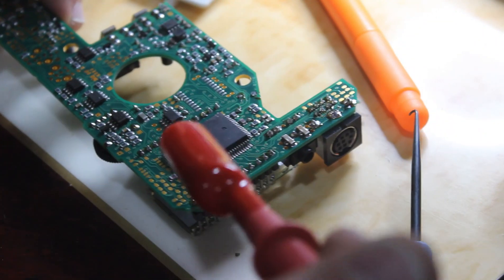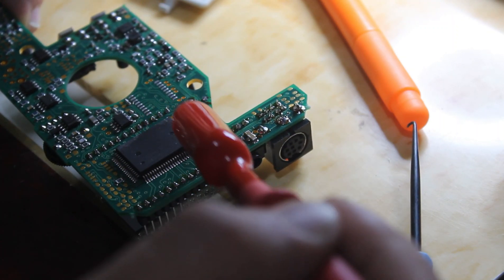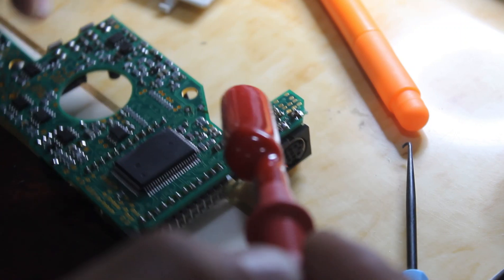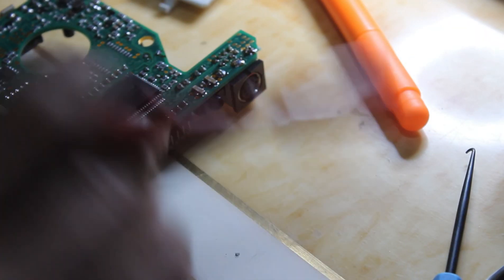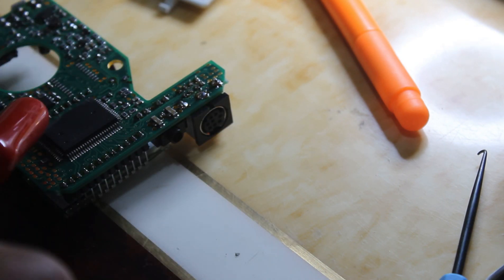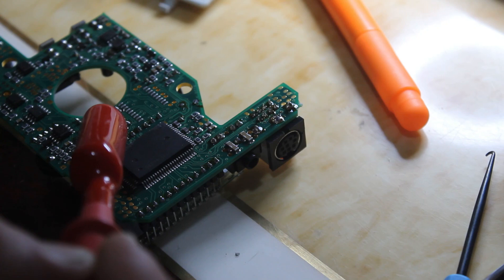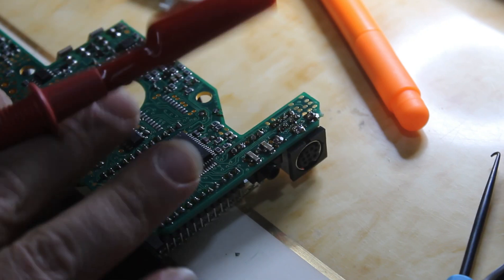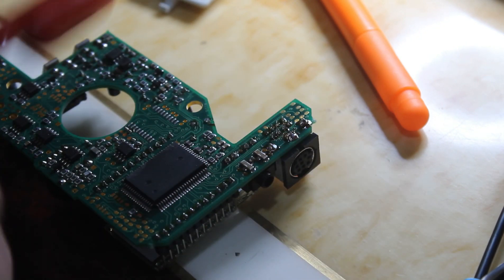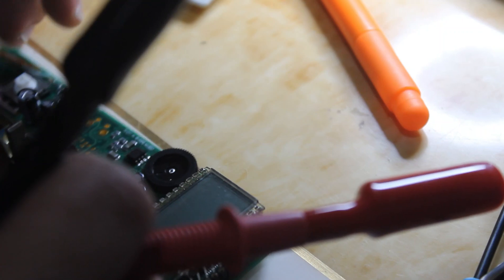This is a microcontroller. Sometimes if we detect a short circuit around the microcontroller, maybe the chip itself is shorting. Here we have a capacitor. We also have four MOSFETs and a coil — this is a power supply section. Because we have nine volts input and sometimes we need to increase or decrease the voltage.